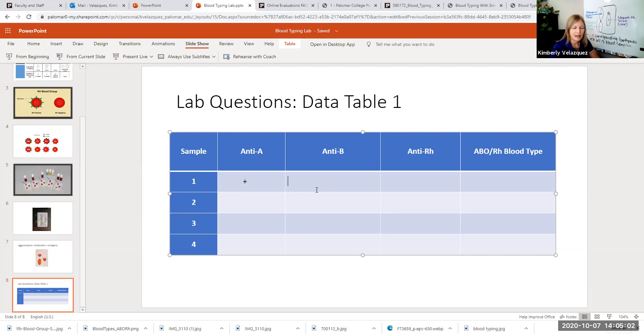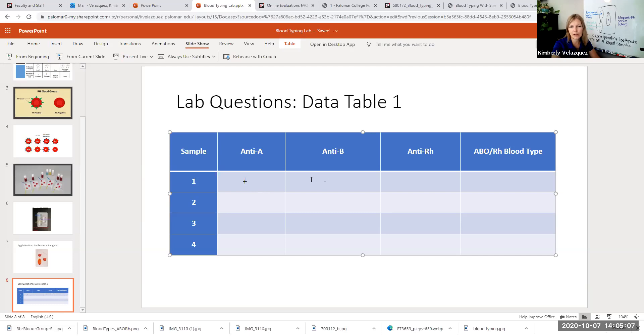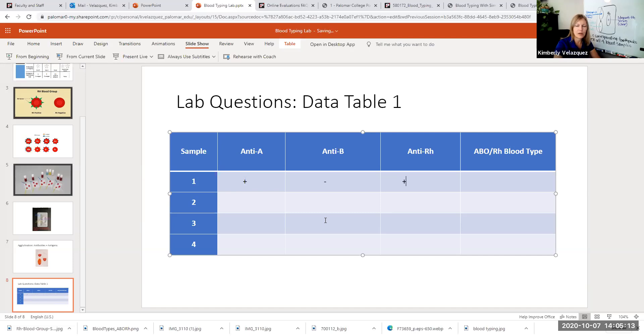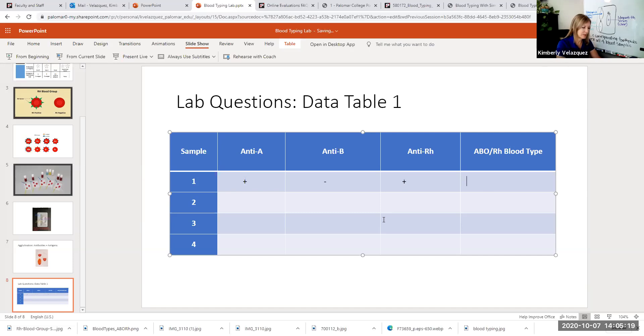So let's say that in our test well, we did have clumping here. So we're going to put positive. We didn't have clumping here. So we're going to put negative. You could also write out positive or negative if you wanted. Let's say here we did have clumping. So we'll call this positive. So this would be A positive blood. So here we would write A positive.